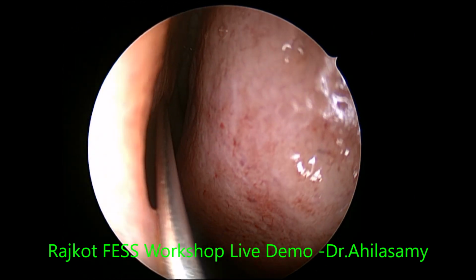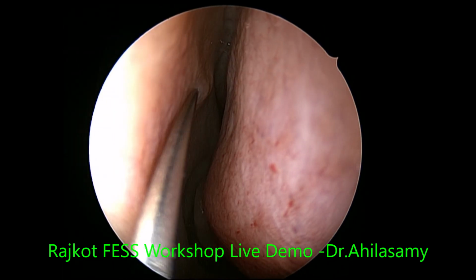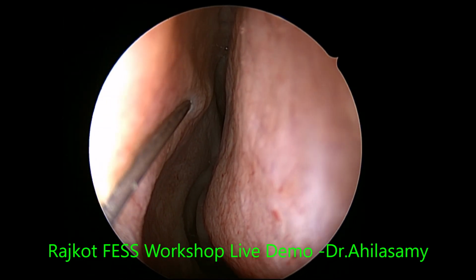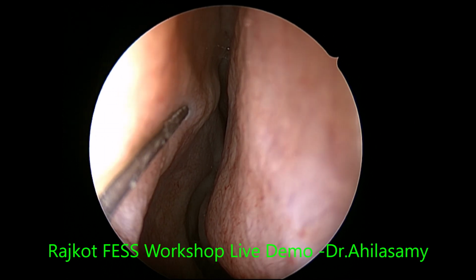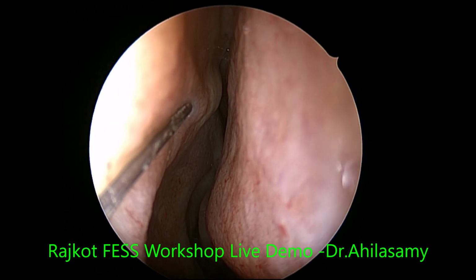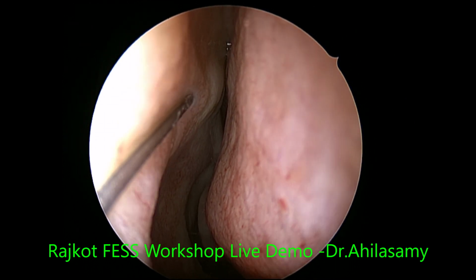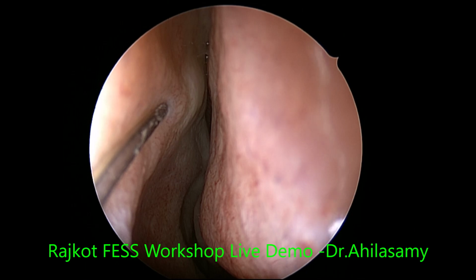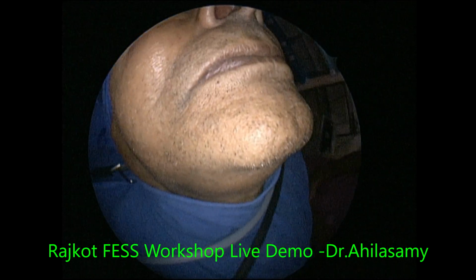Before that, I am giving the anterior ethmoidal nerve block because I will be doing the middle turbinate surgery. For middle turbinate and the frontal recess surgery, anterior ethmoidal nerve block is needed. You give maybe a half cc of local anesthetic. Here the ropivacaine was not available, so I am using 2% lignocaine with adrenaline.